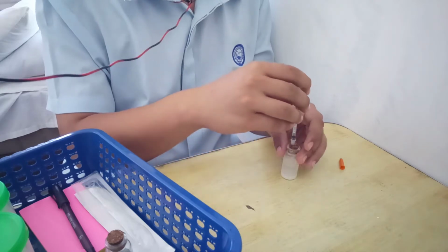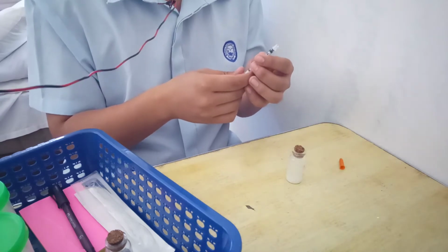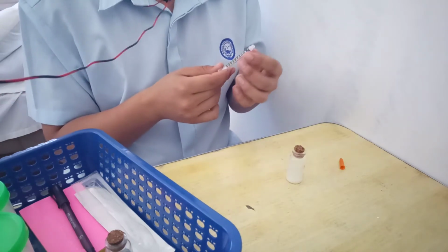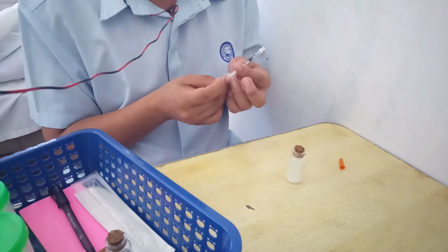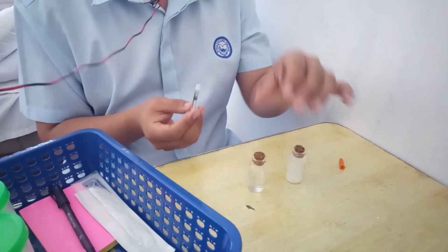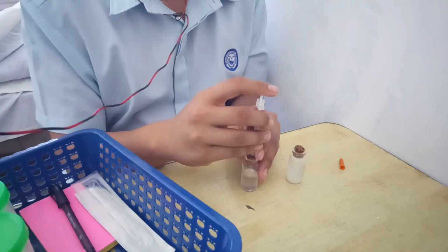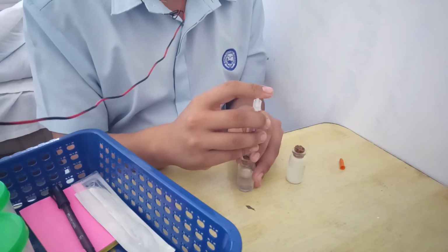And remove the syringe. Using the same syringe and needle, draw the required amount of air, this time for the clear insulin. So let's say the required clear insulin for the patient is 20 units. So we must have 20 units of air. Same procedure, put it on a flat surface and then inject the air into the clear insulin vial. This time, we must keep the needle in this clear insulin vial.